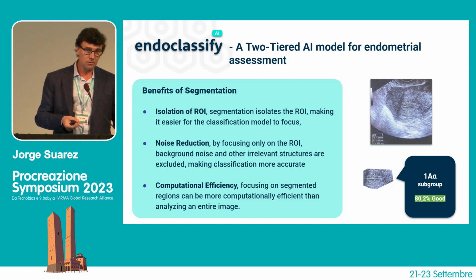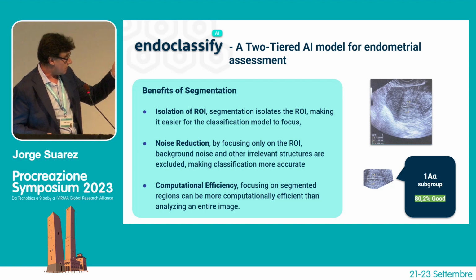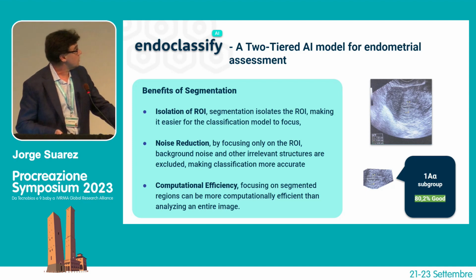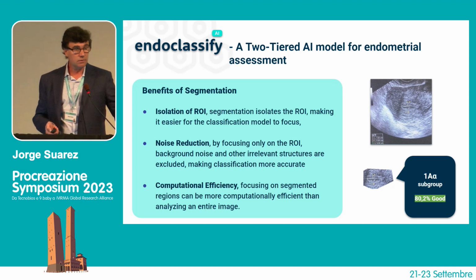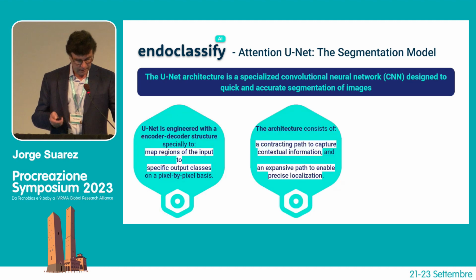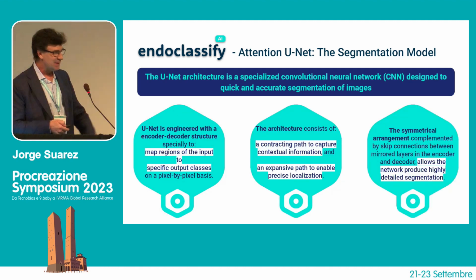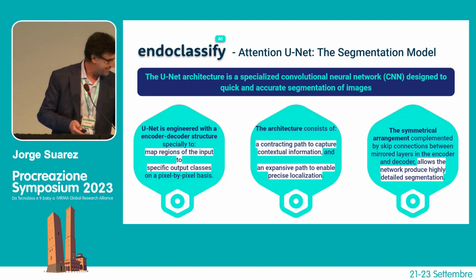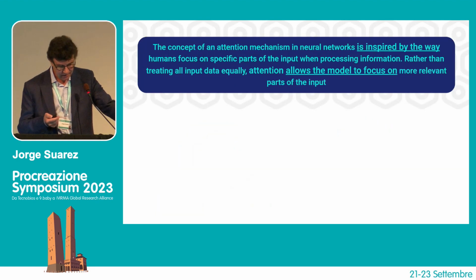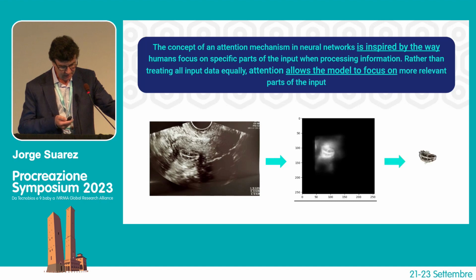You can use it manually, or if you use our endo-classify model, you can obtain the percent of good endometrium without any human intervention. Let me go to the end just to conclude.